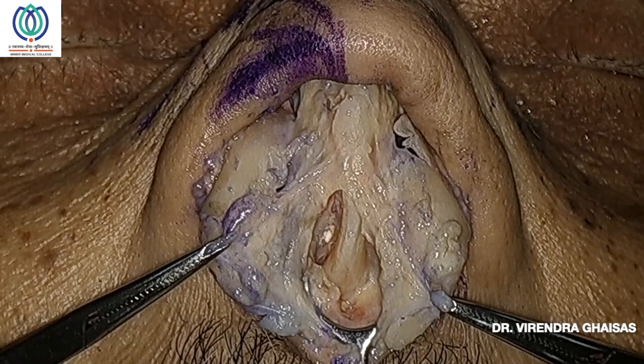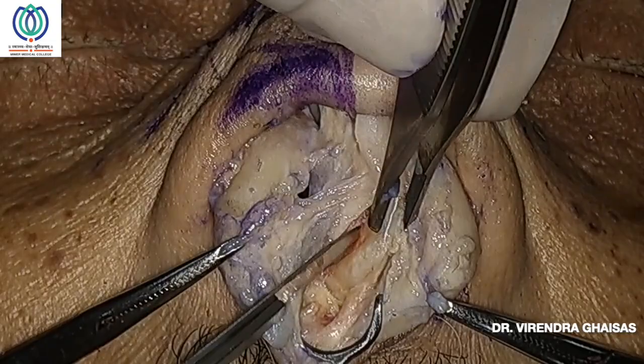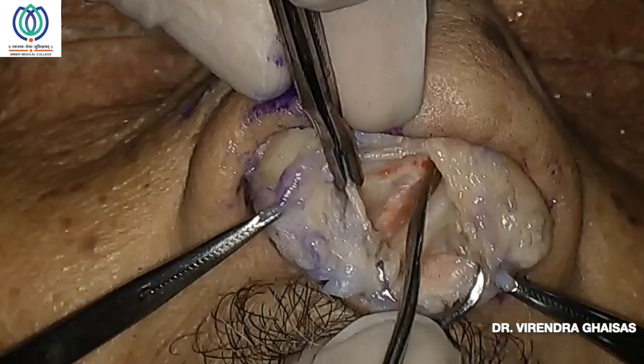Also, you have to dissect the upper lateral cartilage attachment from the septum. Especially in deviated noses, it's important to dissect the upper lateral cartilage from the nasal septum to have a better exposure and for better graft placement of spreader grafts.